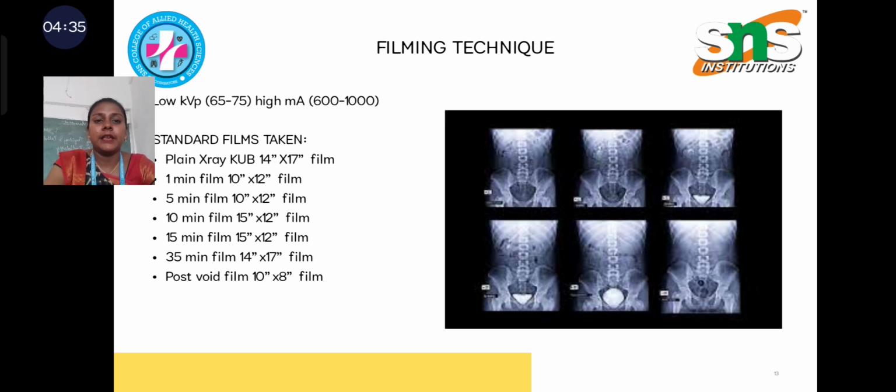Plain X-ray KUB should be on 14 by 17 inch film. 1 minute film should be on 10 by 12 inch film. 5 minute film should be on 10 by 12 inch film. 10 minute film should be on 15 by 12 inch film. 15 minute film should be on 15 by 12 inch film. 35 minute film should be on 14 by 17 inch film. Post void film should be on 10 by 8 film.